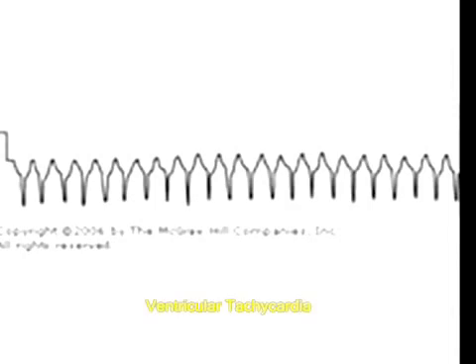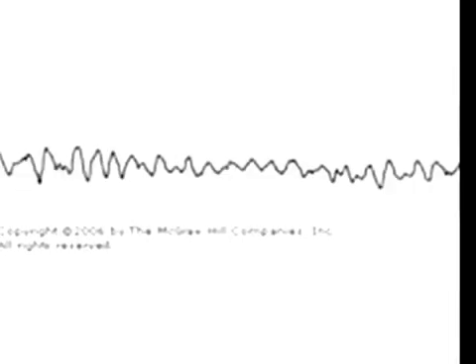This is ventricular tachycardia. In ventricular tachycardia you see three or more premature ventricular contractions and the QRS complex will be very wide. Whenever you see this you should think of ventricular tachycardia — that needs to be treated, otherwise it becomes serious. In this EKG you can see ventricular fibrillation. This is a medical emergency; the main treatment is defibrillation. In ventricular fibrillation, the ventricles are not producing any effective output.